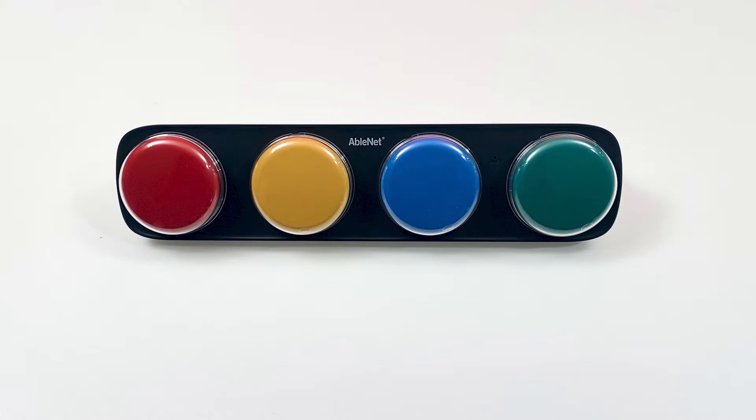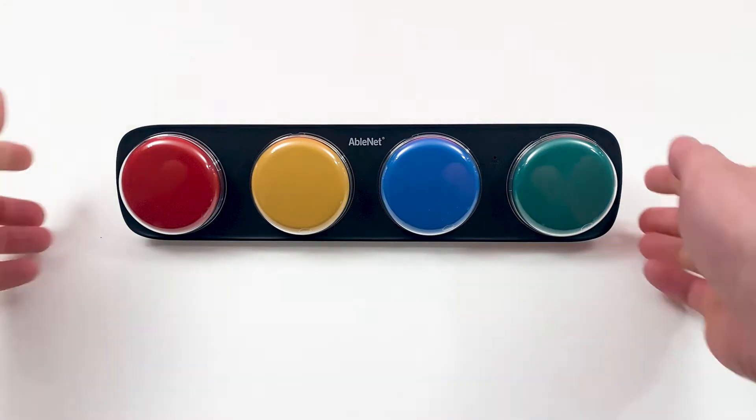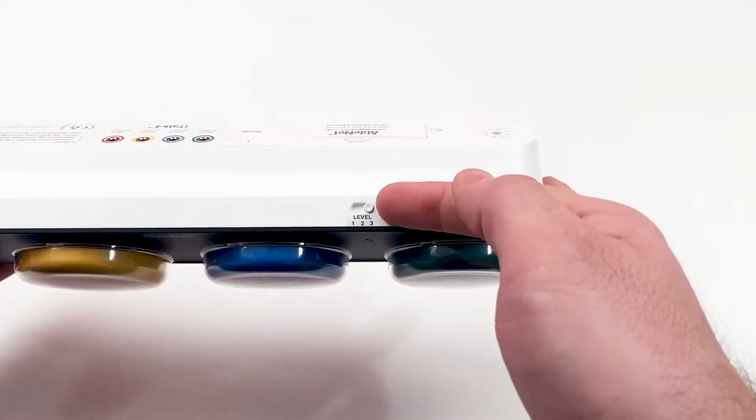The ITALK 4 provides three recording levels for increased flexibility. Use the toggle switch on top of the ITALK 4 to select the appropriate recording level. I will start with level 1.